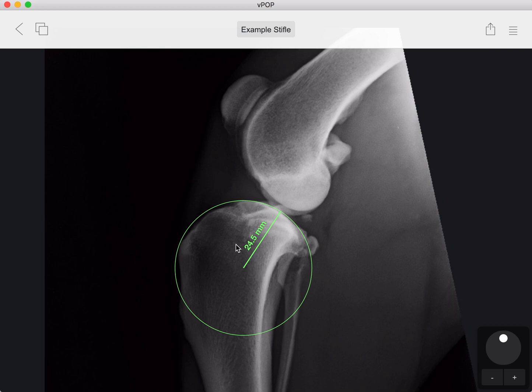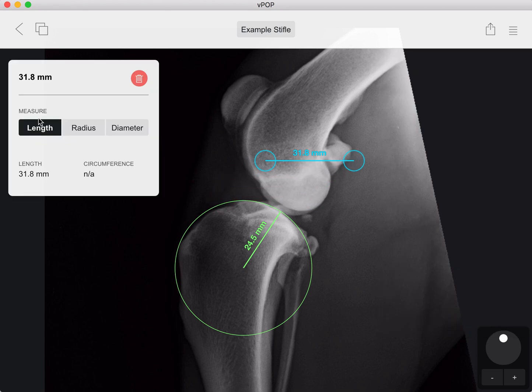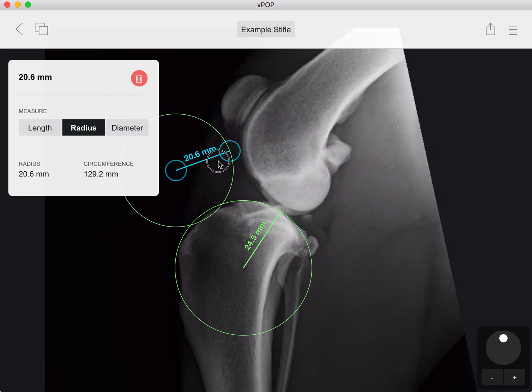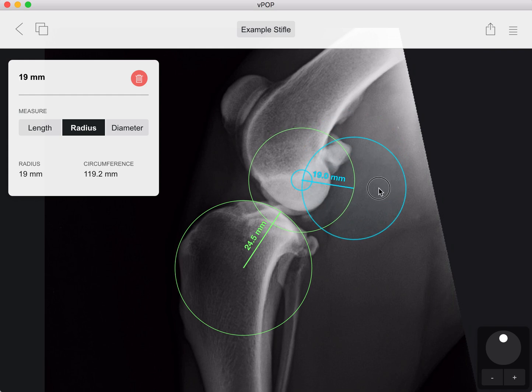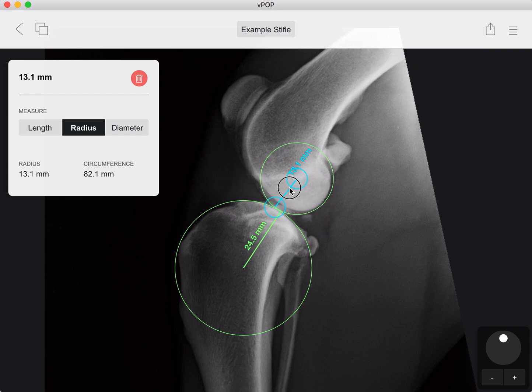That's the radius and circle delineated along the tibial plateau. Now if we wanted to delineate a circle on the femoral condyle, just click up on your menu, go to tools, then click distance, radius and angles. Again we have another line. We can select radius again, move the centre wherever we want around the screen, click and drag the circle wherever we want, and then click on the periphery of the circle to move it and approximate our circle on the femoral condyle.